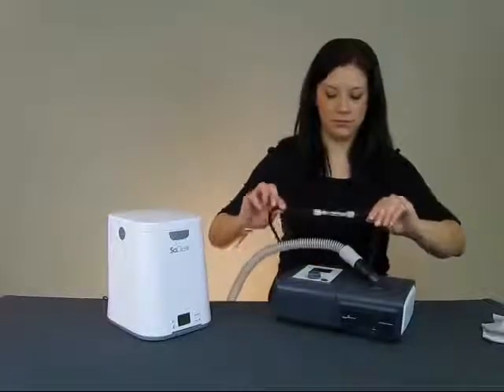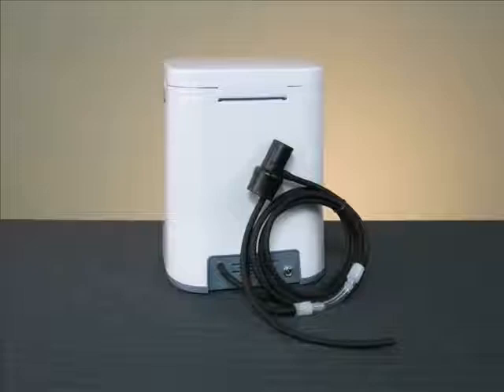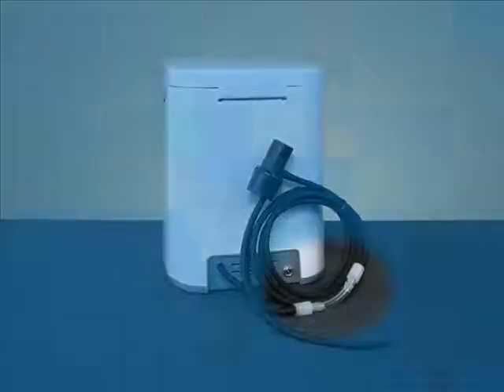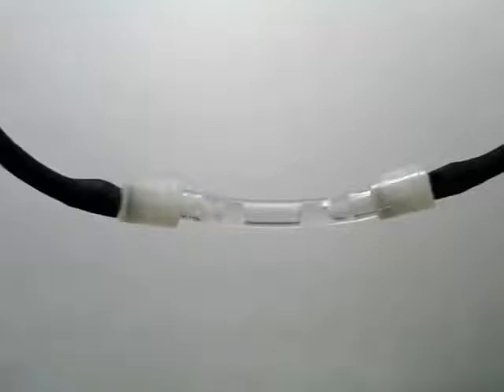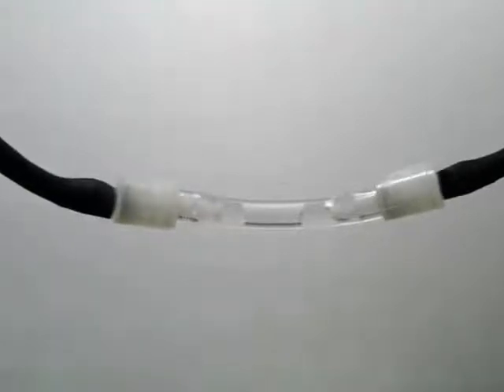The check valve assembly, located along the length of black hose, plays an important role in the SoClean's operation. This system prevents water in your humidifier reservoir from backing up into your SoClean. If you can see water in the clear section of tubing, you should replace the check valve assembly.